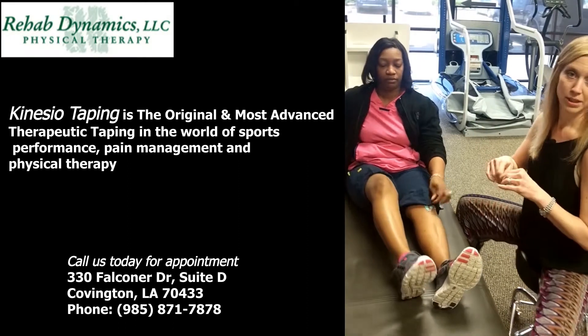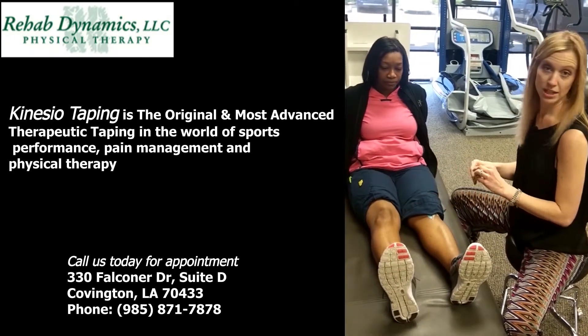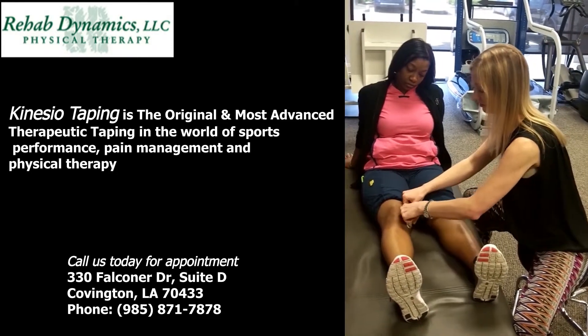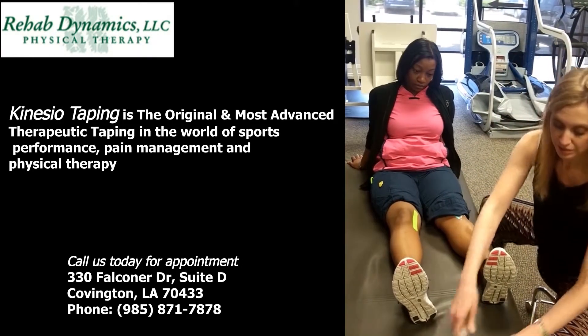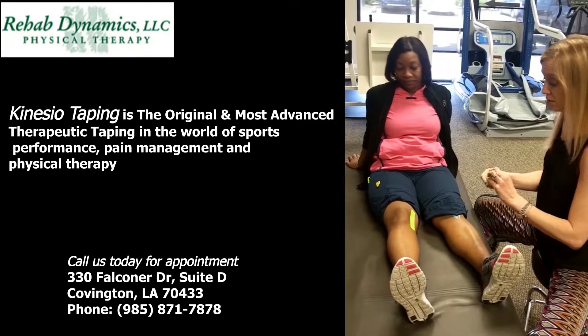The next one is a star pattern that we like to use for pain. In this instance, I'm going to say that she has pain in the inside of her knee. So we're going to cross over the part that has the most pain. Essentially, it's going to lift up the skin and allow more blood flow to the area, which promotes healing.